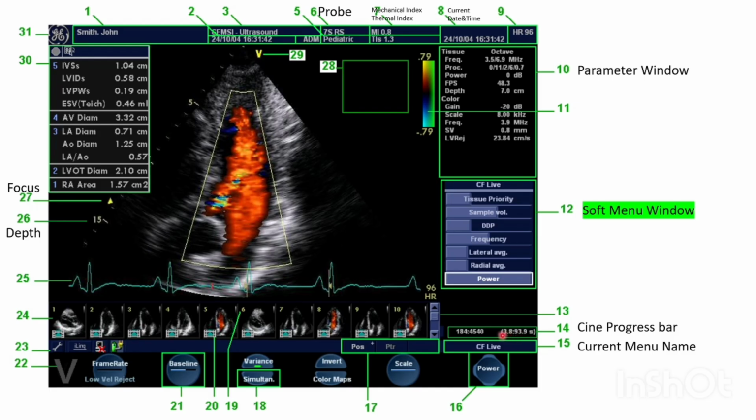So here the maximum limit which we preset before is 93.9 seconds, and now it is playing at 3.8 seconds of that. This is the total length. This is the current time, and this shows the frame. That is, a total of 4,540 frames are there in this video, and we are currently at the 184th frame. So frame by frame we can access here.